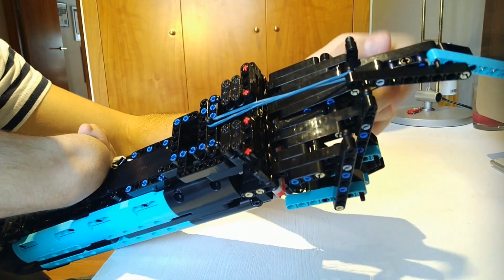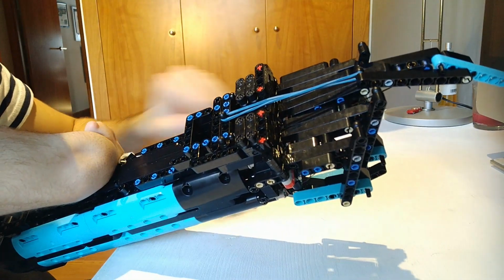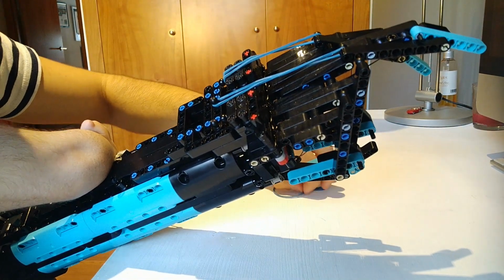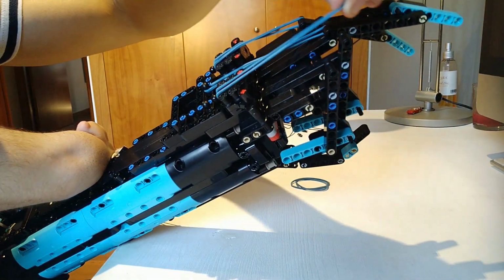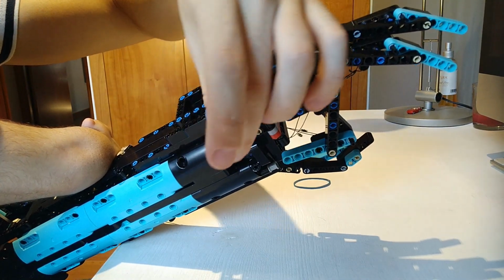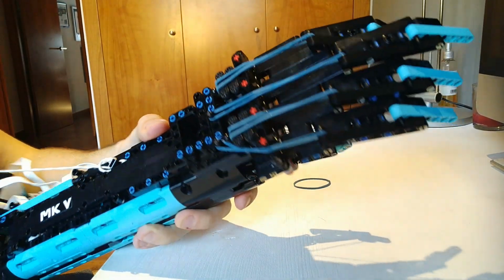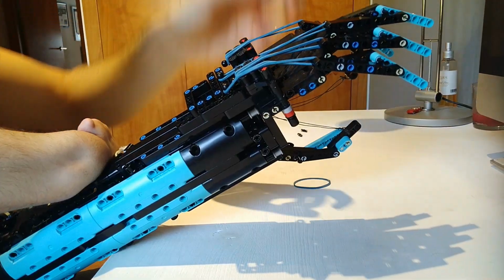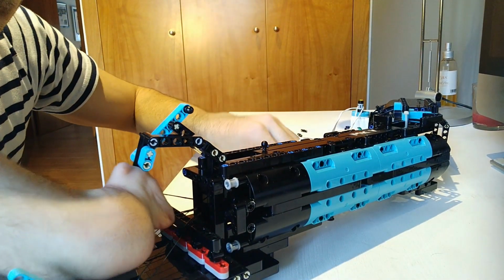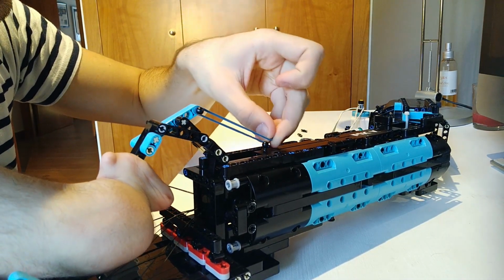And now the finger is completely tensed, and you can actually have an open arm the entire time. The next one is right here. You connect this here. The next one is on the other side. You connect it to the finger. The last one of this side is right here. You pull it like this. It should look like this. Or if you want, you can pull this one on top. So it's a bit tighter. And now on the other side, you need to connect this brick with the rubber band. And that's it.